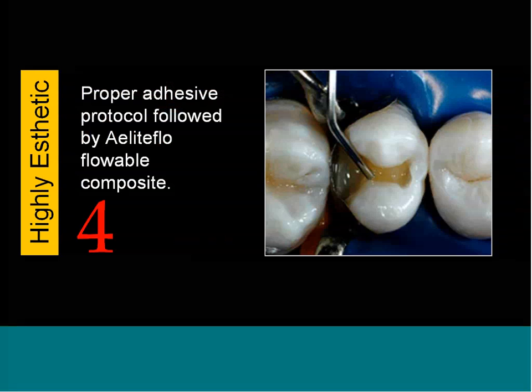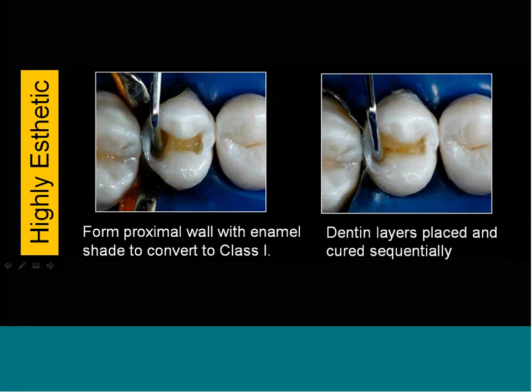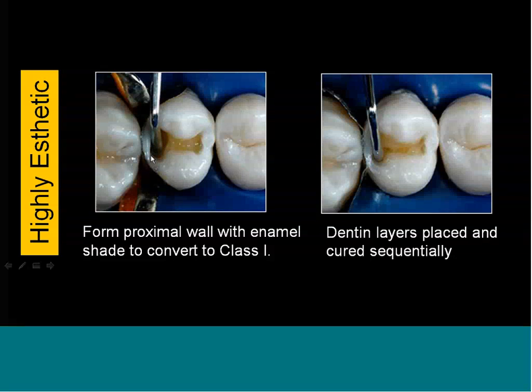So in this case, we're going through the proper adhesive protocol, putting in a flowable like we talked about down into the proximal box, light curing that. And this is called a centripetal buildup. That's a procedure in which you take any proximal wall that's missing, mesial, distal, buccal, lingual, and build it back, creating basically a class one, which is a lot easier. If you ask a doctor, what's easier to restore, class one or class two? It's always a class one. You're just filling in basically the central part when the periphery is already taken care of.